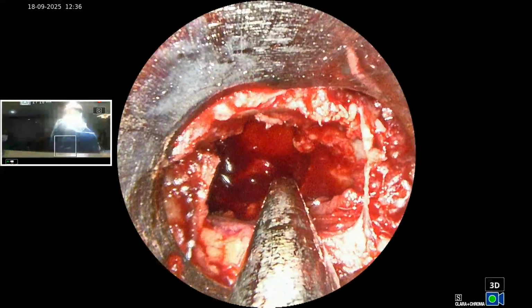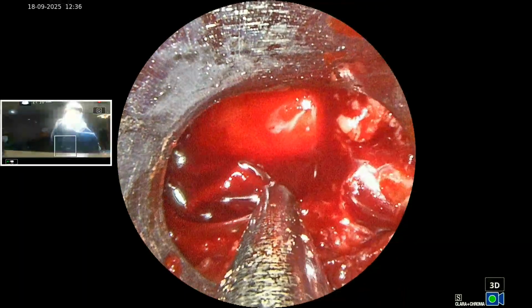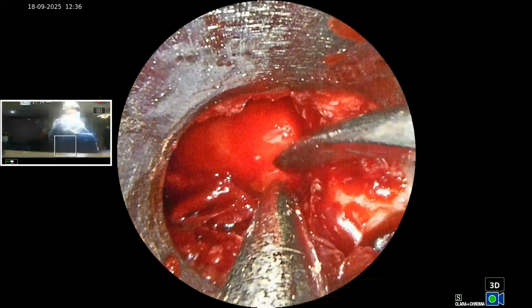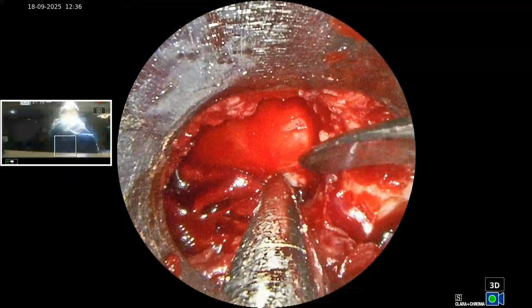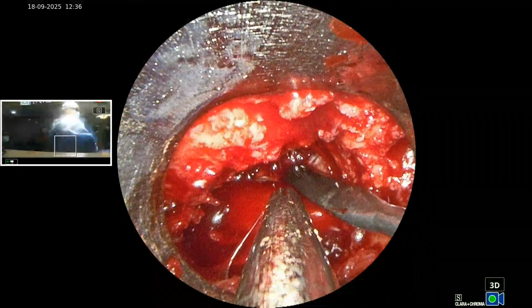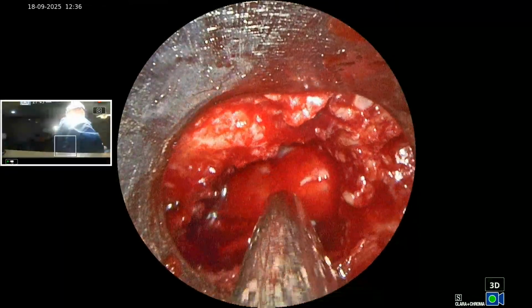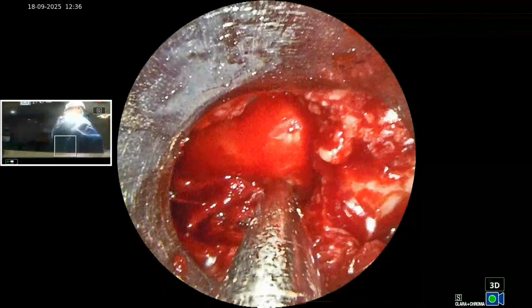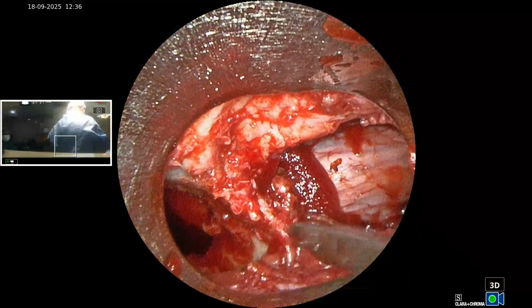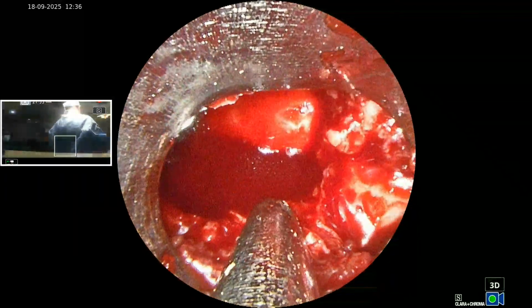This is the L3-L4 level, keeping the bony bridge intact from the single port. You can see my hand movement and outside picture. This is the port. This is the nerve root of the L3-L4. That means this is the opposite side L4 nerve root. So bilateral over the top decompression from the single port, very nicely due to the mobility and beauty of this instrument.